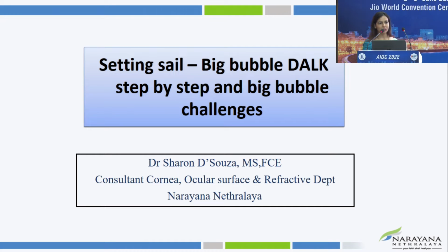So I'm going to run through a little bit of basic DALK steps, especially the big bubble DALK, and then we'll hand it over to our next masters who will take other steps.